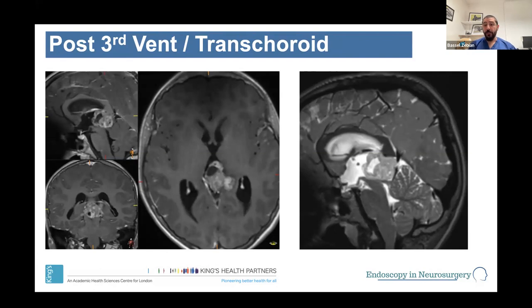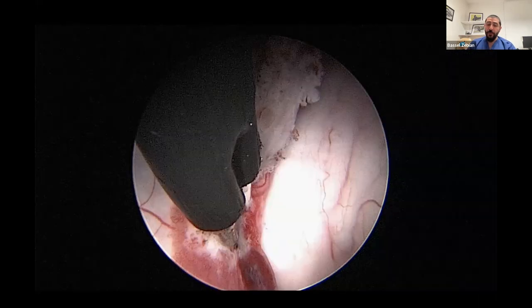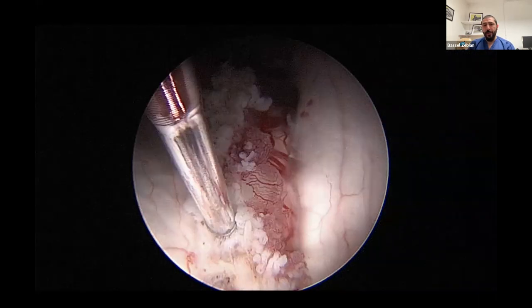We've now been able to take out a similar type of tumor, a 3-centimeter teratoma from a child, by splitting the posterior aspect of the choroid fissure. We haven't even had to take out the anterior septal vein. And increasingly, I've been able to develop the technique where we can do that. You have to be careful with the internal cerebral veins, of course, but that's the case with pineal tumors. Always, it's the veins that you have to be careful with.